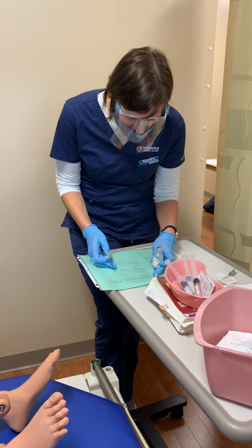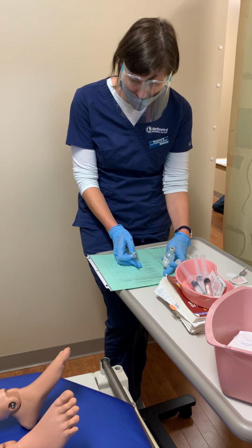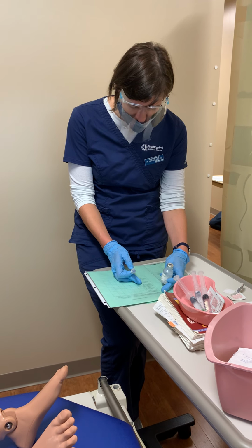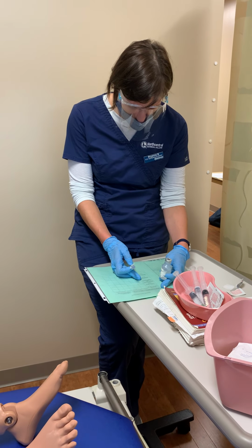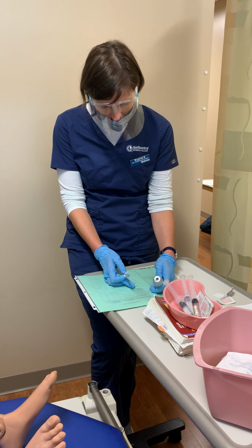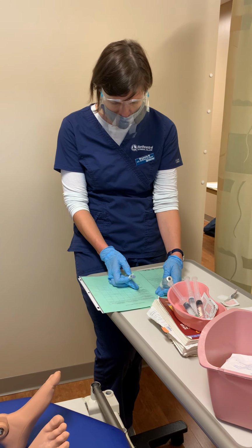Again, it's Frances Christensen, and we have our morphine IV push. I'm giving that every 1 hour as needed. More than an hour has passed since her last dose, and we are giving 2 milligram. So at 10 milligram per 1 ml, that equals out to 0.2 ml.